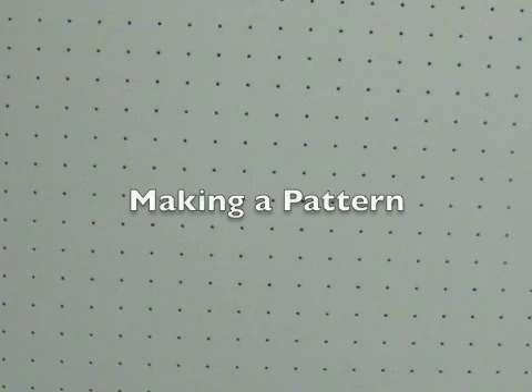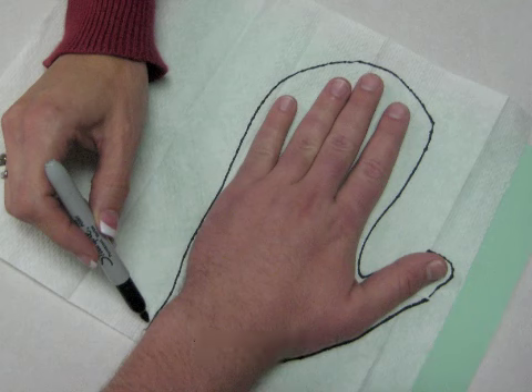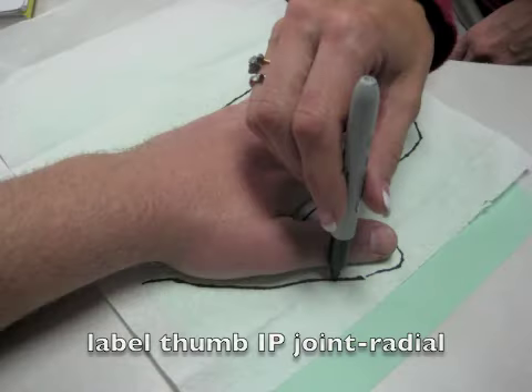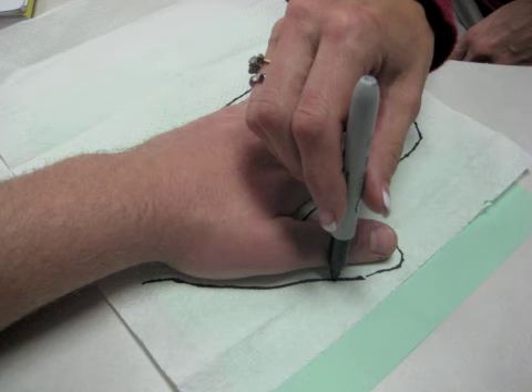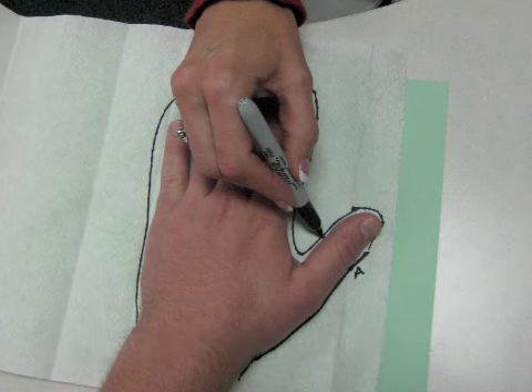When making a pattern, it is helpful to use a paper towel or another type of thin paper that can be wrapped around the person's hand to check for fit. First, trace the person's hand onto the paper. Mark the IP joint of the thumb on the radial side and label it A. Then mark the IP joint of the thumb on the ulnar side and label it B.